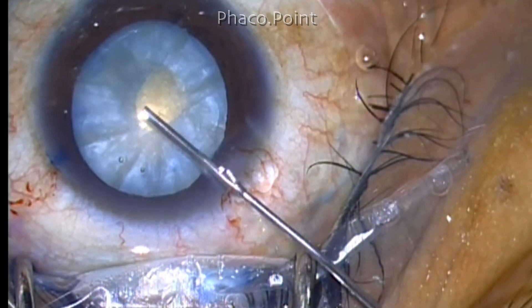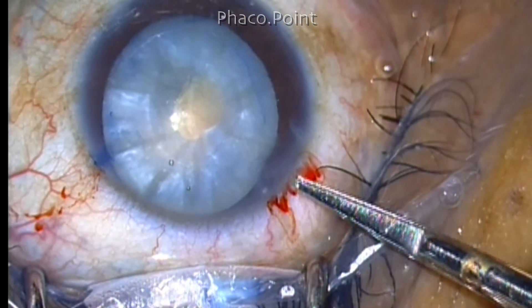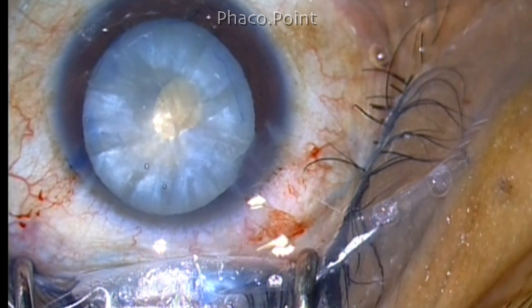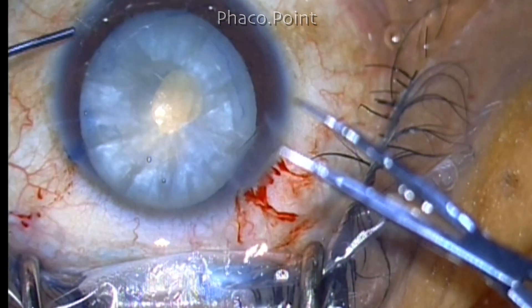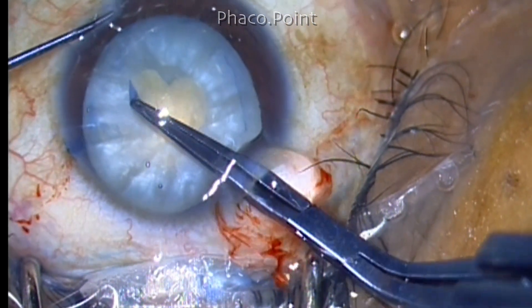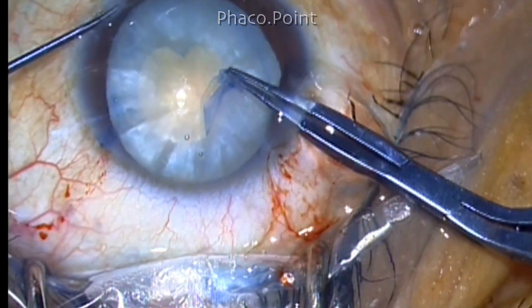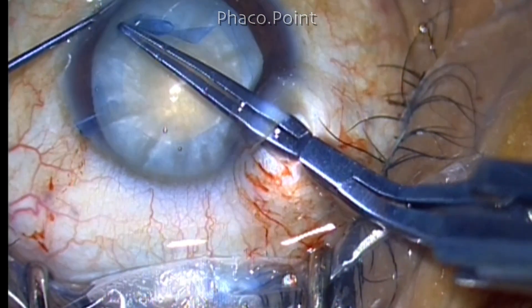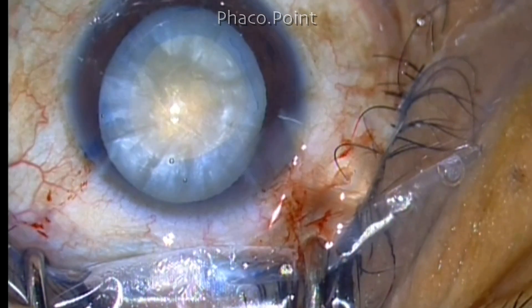Now once this is done the chamber nicely deepens out. I'm using a straight Vannas scissors; it is better to use a curved Vannas scissors so that you get a curved cut rather than a radial cut. However I did not have a curved Vannas scissors so I made a straight cut. Because we have decompressed the back, there is no risk that this will run off to the periphery. Then using a Utrata forceps — in this case I'm using an Innermura forceps — gently grasp the edge and create the capsulorhexis. You will find that there is no tendency at all for this rhexis to run off to the periphery and you can get a nice central, highly circular, well-centered capsulorhexis.